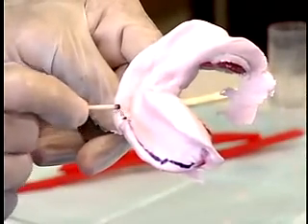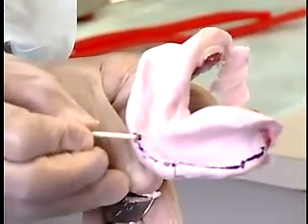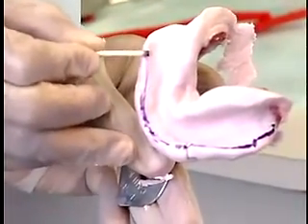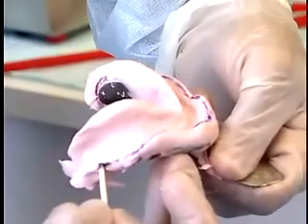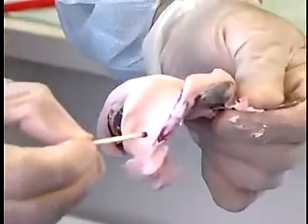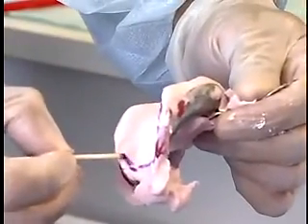Disinfect the impression using current recommended surface disinfectant for 10 minutes in a sealed bag prior to proceeding to the lab. Alginate impressions tend to be overextended, so the denture outline should be drawn on the impression with an indelible stick. This outline will be transferred into the cast and will be helpful to fabricate the custom tray.